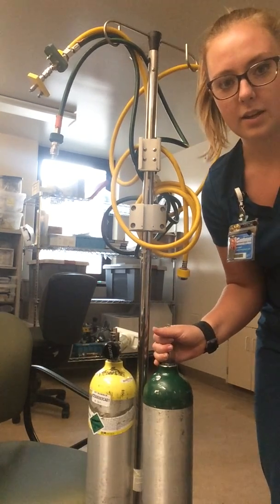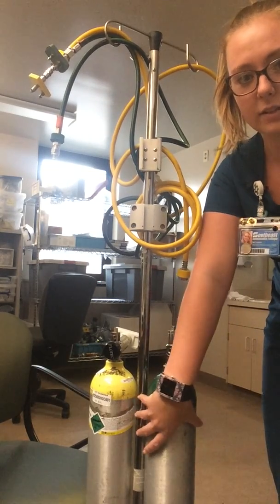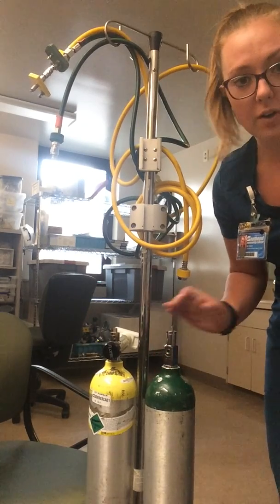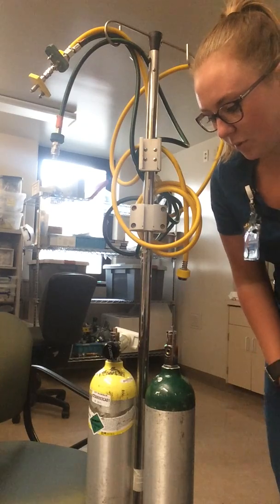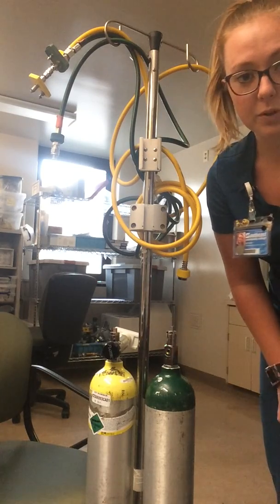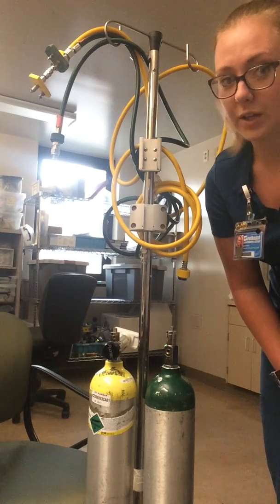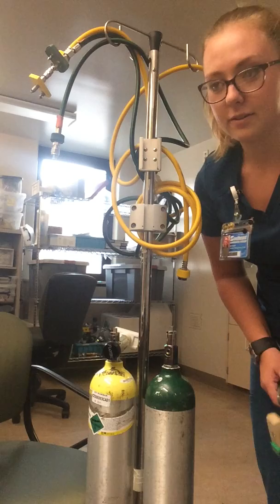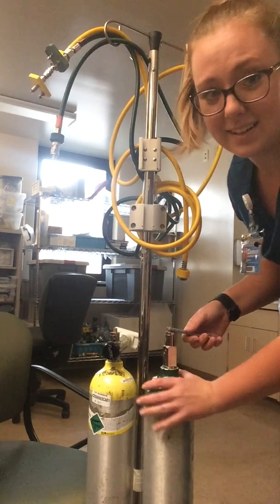First of all, this is an oxygen tank. Most importantly, it is secured in a stand so it's not freestanding, so we don't have any incidents with it falling over and possible harm from that. Second most important thing is that there is nothing flammable — no smoking, no chapstick or petroleum products or anything like that that could possibly cause a fire to start.